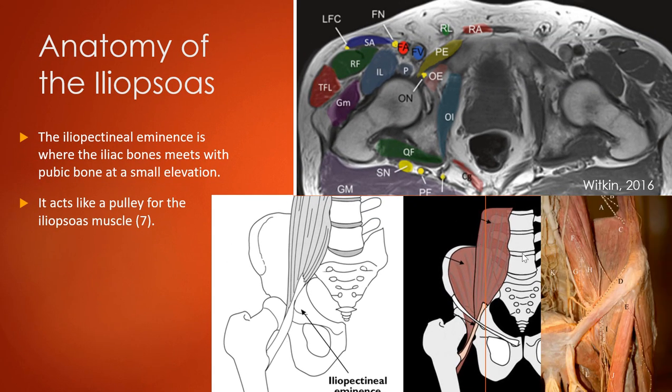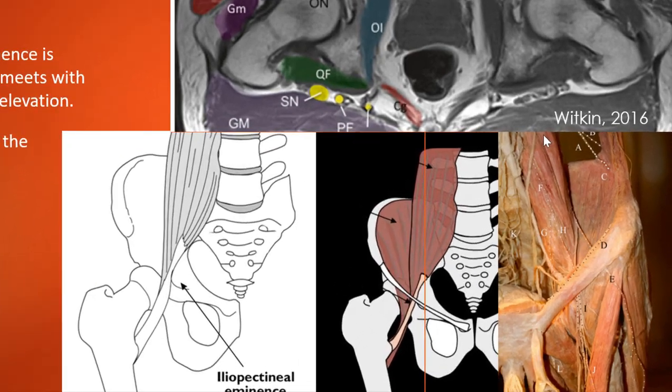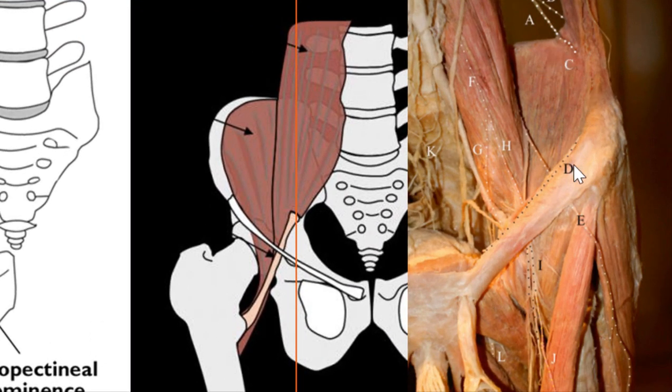That's revision of anatomy. Here it is in a cadaver, so we can see psoas, we can see iliacus, inguinal ligament, we can see pectineus here, and sartorius arising from the ASIS. And this is our iliacus fibres extending down, and the iliopsoas tendon sits in here. So the iliopsoas tendon, we're going to find it if we're looking deep to the femoral artery. Sometimes if we slide our probe in from lateral to medial, we can use the sartorius and the iliacus as a muscular acoustic window to the psoas tendon.